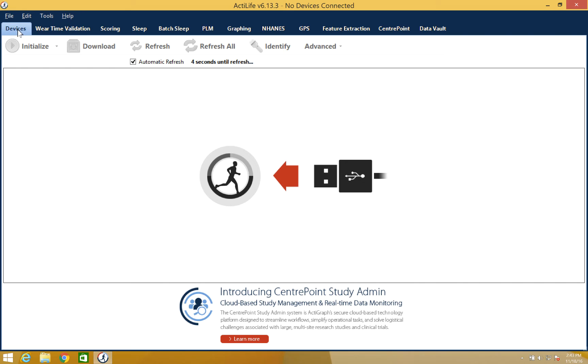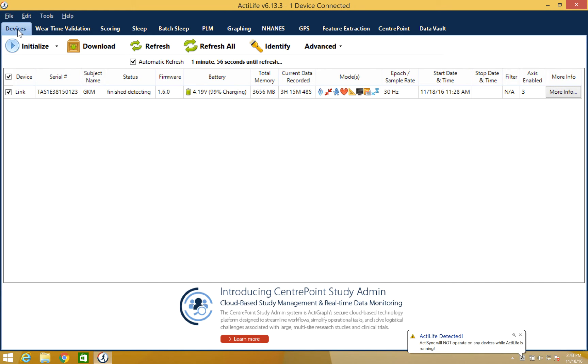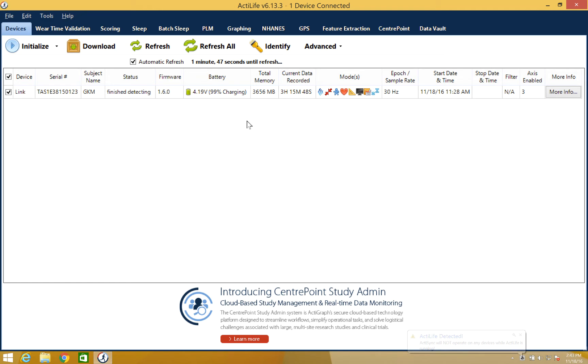Now you can plug in your ActiGraph device using a USB cable or if you're using the GT9X link device, the link docking station. Once the software recognizes the device, it will appear in the devices grid. Here you can confirm that the device contains data for this download by looking at the current data recorded column.